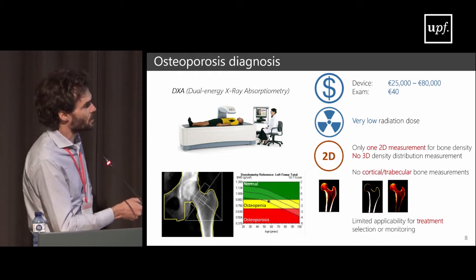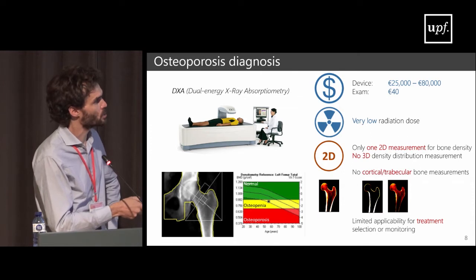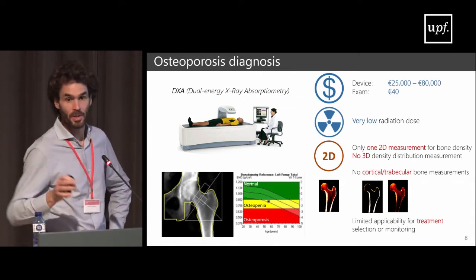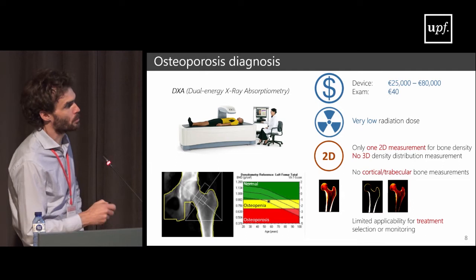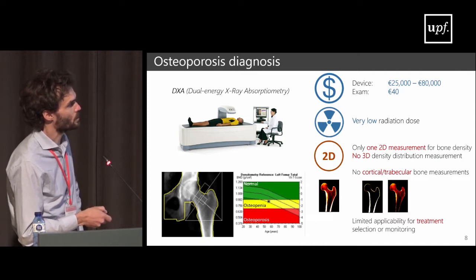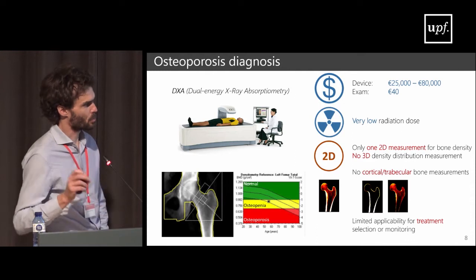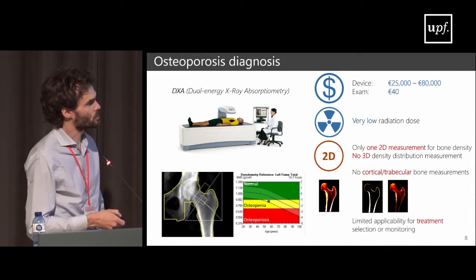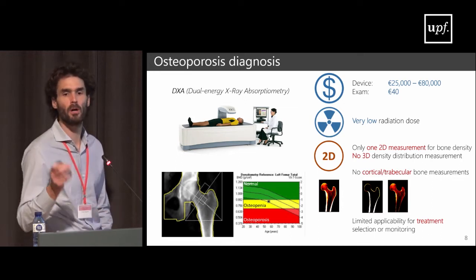That's also a quantitative image, which means that at every pixel, what you measure is the projected bone density. So you can measure the bone density in that image. With that image, typically the system would calculate the bone density in specific areas. The area that is used the most is the total femur, which includes the neck, the trochanter and the shaft. The system gives you 1 value, the average bone density in this area, and then it uses age-related reference data, such as this graph, to compare that value of this patient to the young normal population.